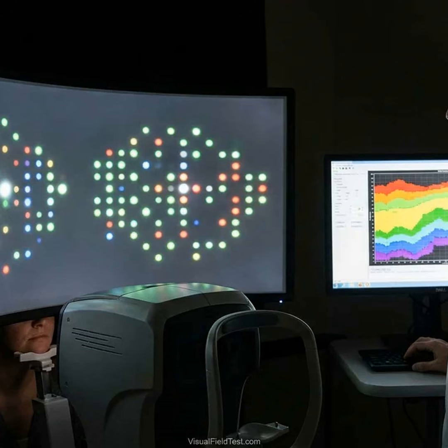Notably, critical flicker fusion, CFF, perimetry, which finds the highest refresh rate a person can detect, has been found superior to standard white-on-white perimetry in detecting glaucomatous damage. In other words, testing how fast a light can flicker before blending into steady light can reveal loss of function that normal fields miss. FDT perimetry is already used clinically as a glaucoma screen.